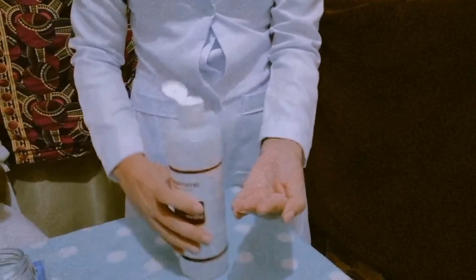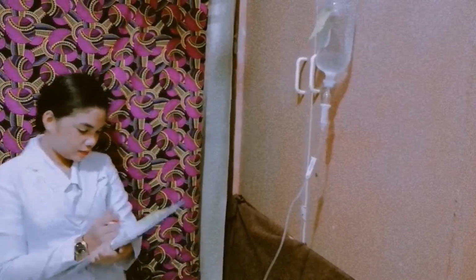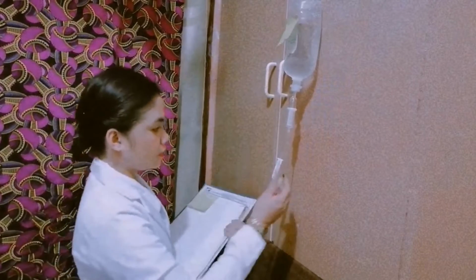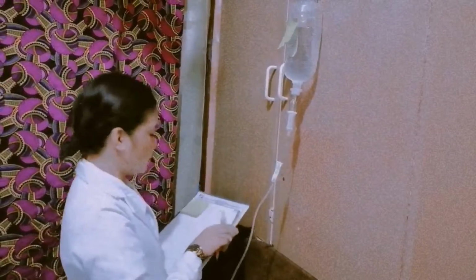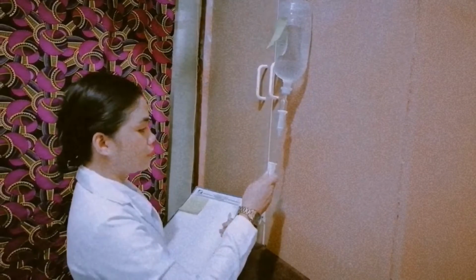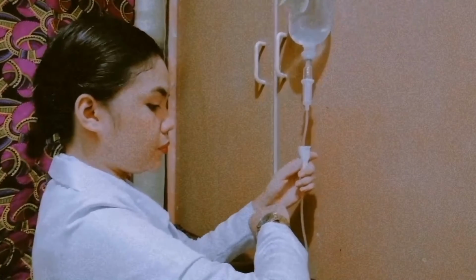Deter the spread of the microorganisms. The next procedure is to document the procedure and the client's response. Chart the time, site, device used, solution, and rate of flow, and the physician or nurse who inserted the needle. This provides accurate documentation and ensures continuity of care.